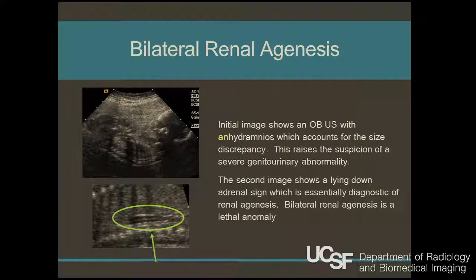And I'm sure some of you read OB ultrasounds, and oftentimes you get that picture and the text saying, here's the kidneys, and you're looking, and you're like, I barely even see the kidneys, because they kind of blend in with the surrounding tissue. So imagine if you have no fluid, the kidneys are even harder to see. So instead of going to look for something that's not there and proving it, we'd go and look for something that is there, and that's called the lying down adrenal sign.